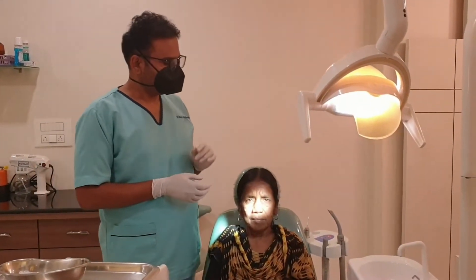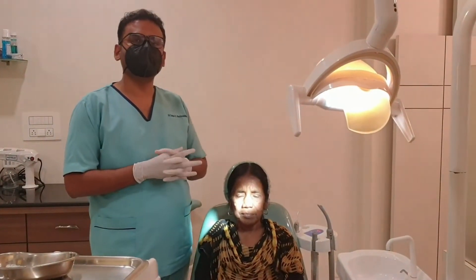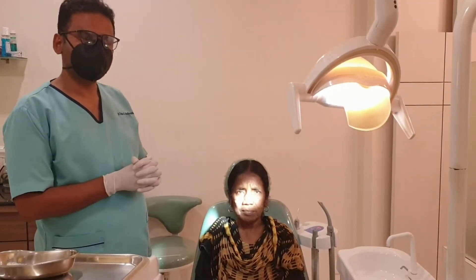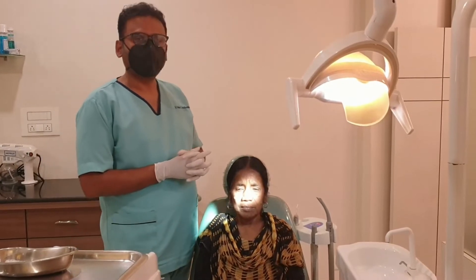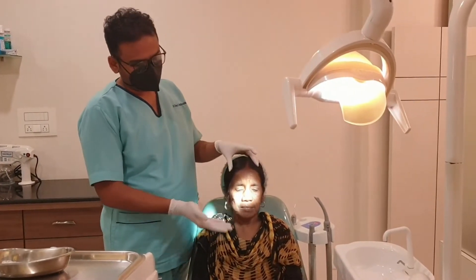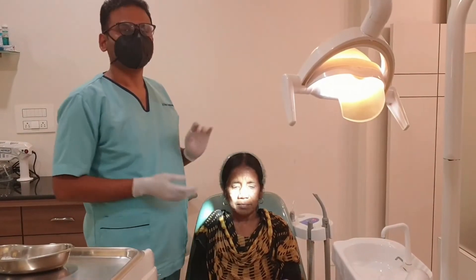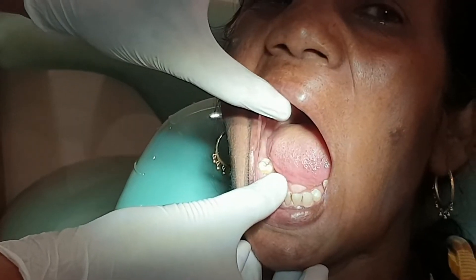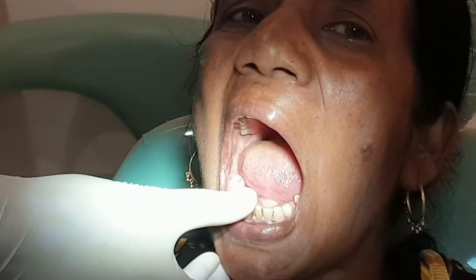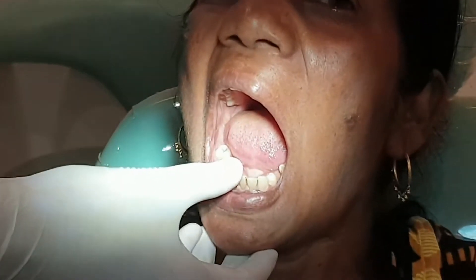For the technique, the chair position is first established. The patient is seated comfortably in the dental chair so that the mandible is parallel to the floor. The patient is asked to open the mouth wide. Either the index finger or thumb can be used for palpating the landmarks.